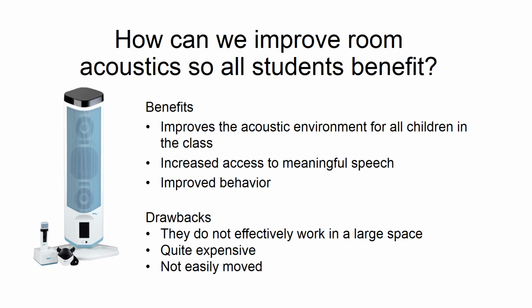However, if a HI or deaf student is not moving from classroom to classroom very often, or is based in one specific classroom, they can greatly benefit from this. The sound field offers other functions, such as being able to capture lessons, and when this is also linked with the PowerPoint, enables whole lessons to be recorded and watched again at a later date, or sent out to students, particularly useful if there were to be a global pandemic. Specifically, for a HI deaf student, the radio aid can be plugged into the soundfield system, meaning that whilst the rest of the class benefit from better access to what is being said, the HI deaf student still gets all the benefits of the radio aid, but without the shouting.